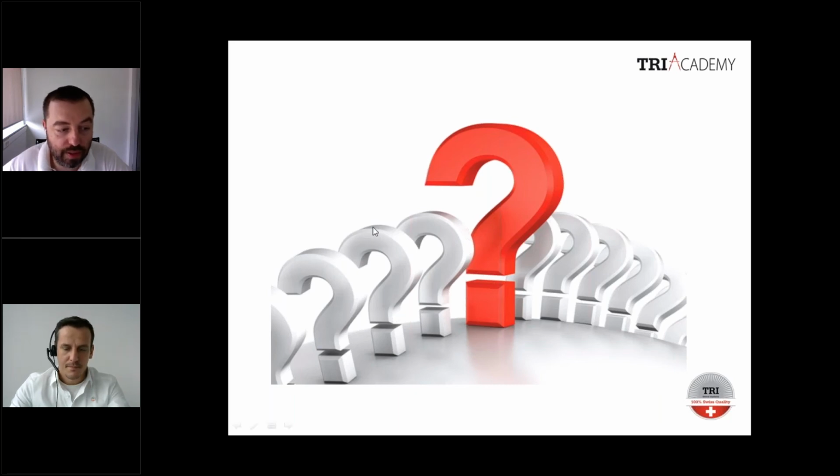First of all, there are two answers for that question. Usually, to get this type of outcome, when we place the implant, we can also enlarge a little bit, like a bone spreading from the interior. So we go only with the first two burrs, and then we go with an osteotome and enlarge the bone plate, such that we get this emergence of the tissue.